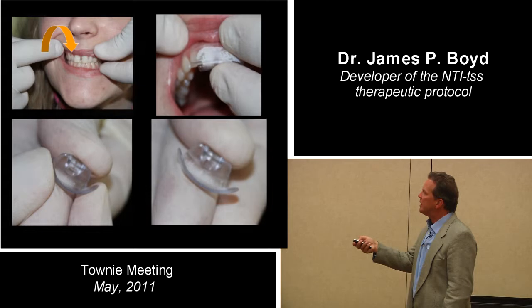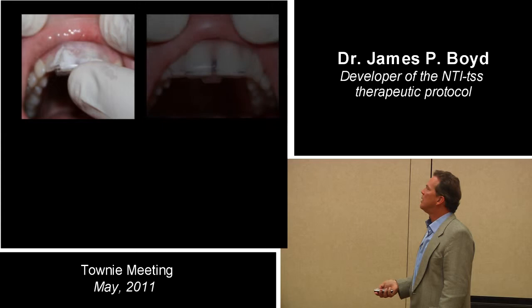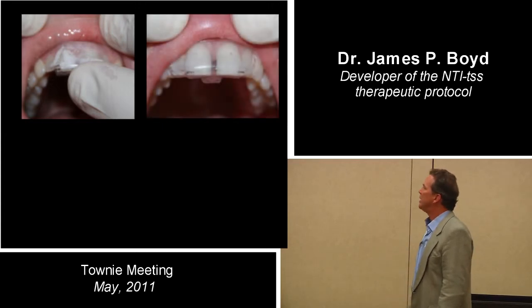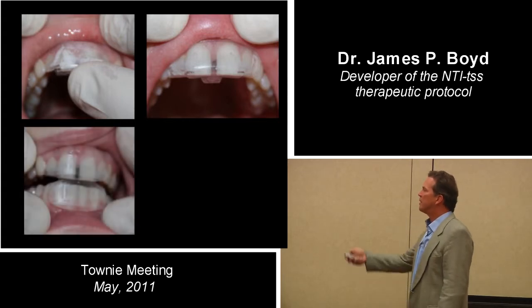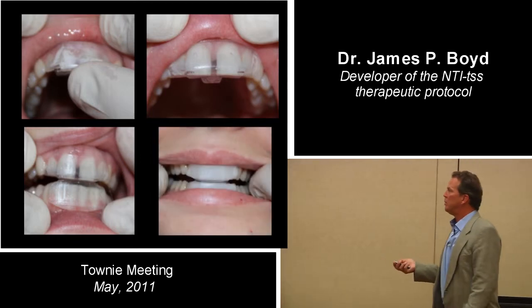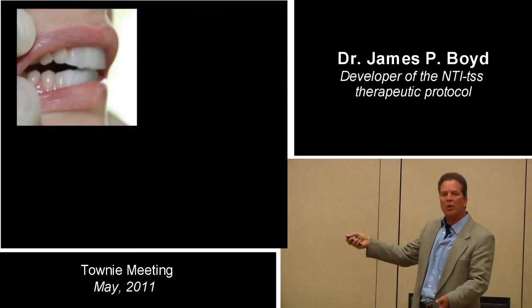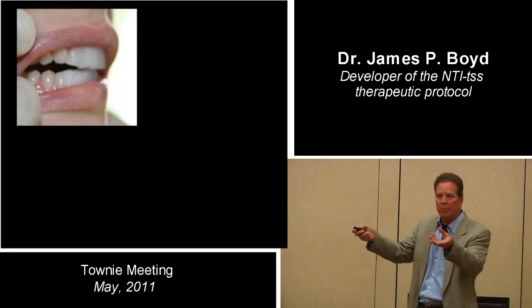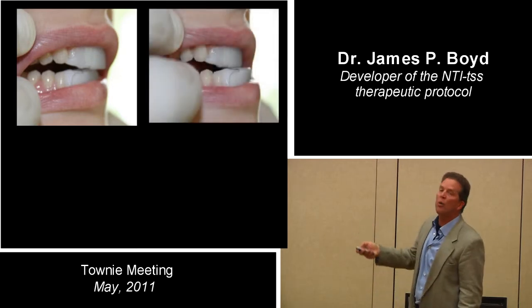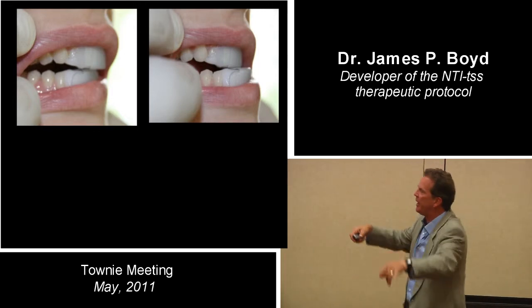So now you see how it's real tight against that lateral. And now it's not too high up here because it's a much lower profile. It doesn't stick up into that sulcus. And there's the thermoplastic. And that was really easy for me to do. And then retrusive, the discluding element on the upper one is already sort of pre-ramped up to keep it minimal vertical. Now when they go protrusive, you're on the lower discluding element. So there's nothing sticking out in their lips anymore. All the DEs are inside, nothing on the outside.